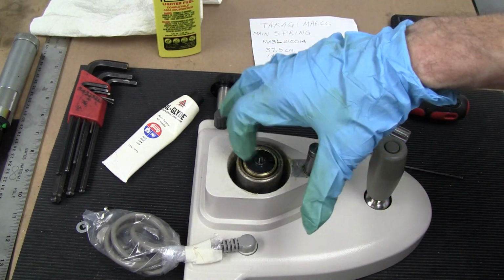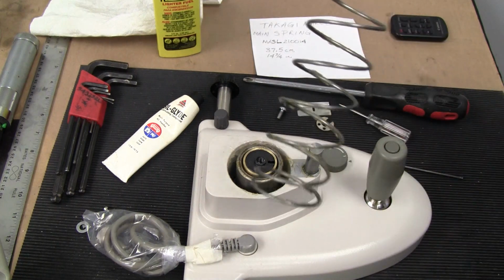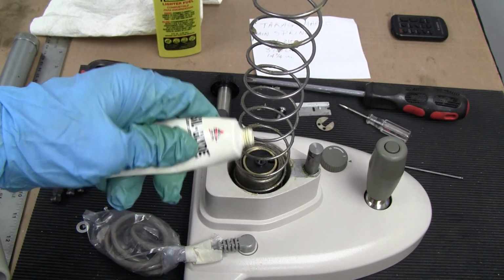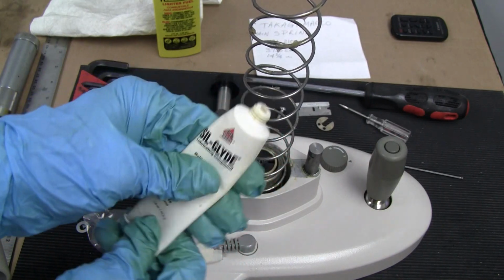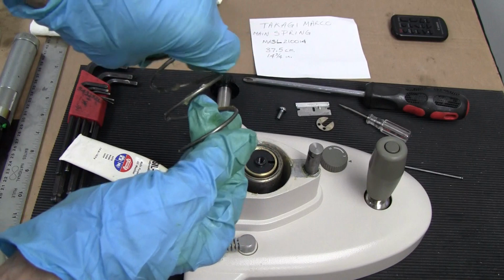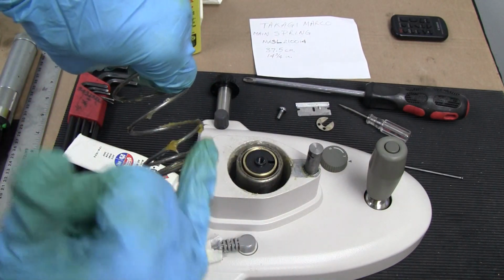If this brass collar came off, then you make sure to put it back on, and you want to put your spring on, and we have to make sure that we lubricate it with some grease. This is some Sil-Glyde, and make sure that your spring has grease on it. Marco uses a really strong, thick grease, and this will be sufficient.